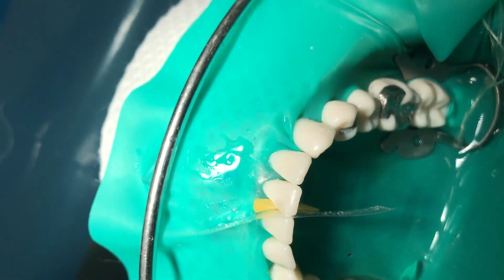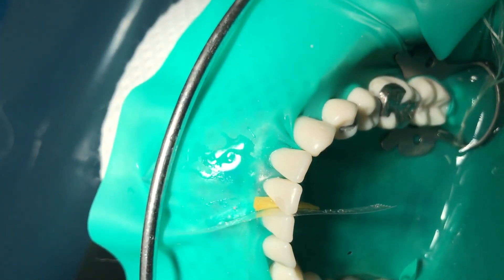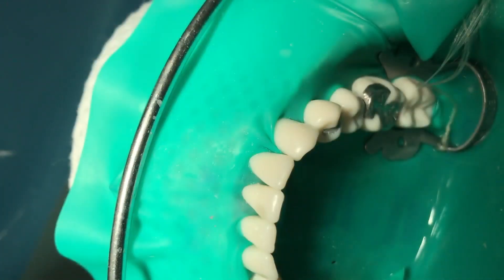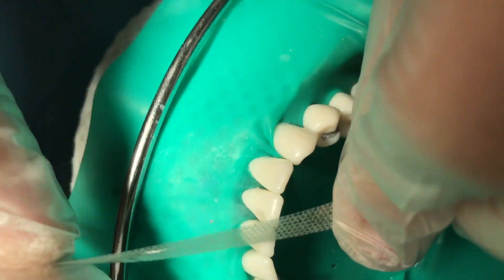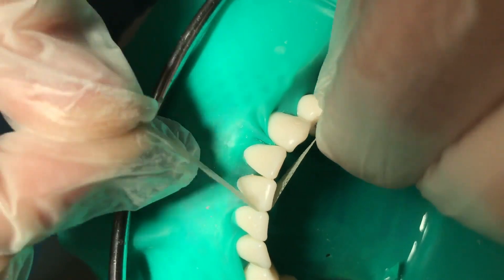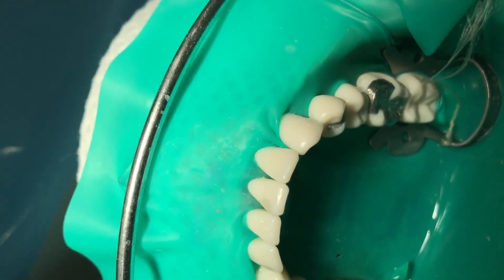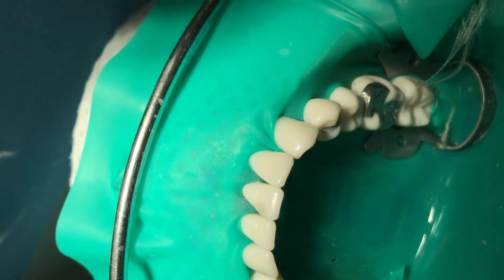If your composite is already smooth, you can start with the finer discs. You can finish the interproximal surface using finishing strips. If your interproximal surface is smooth and your contact is good, you can start with fine and extra fine. If not, you can start with the coarser one.